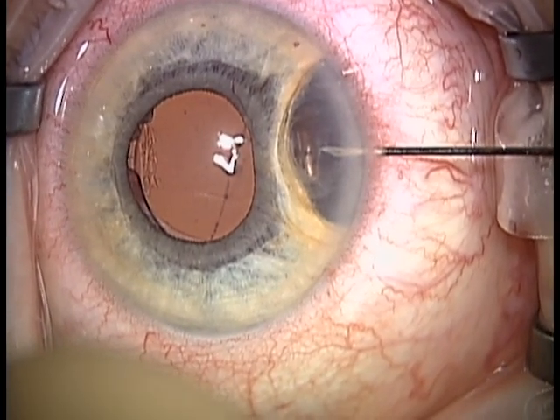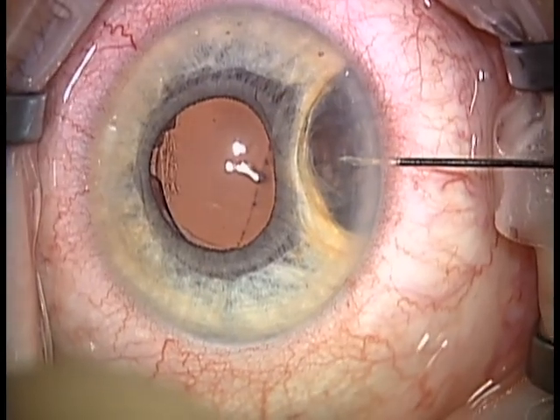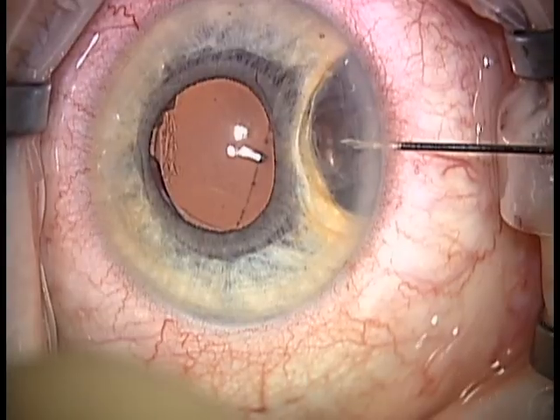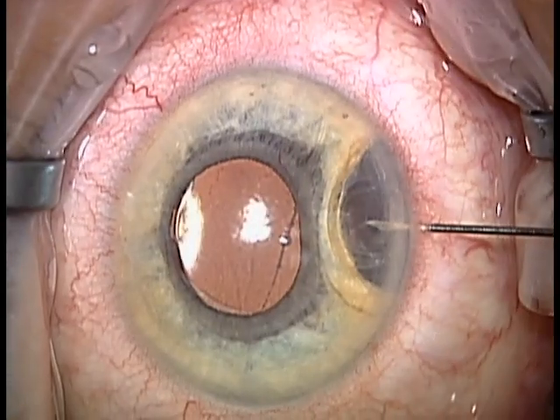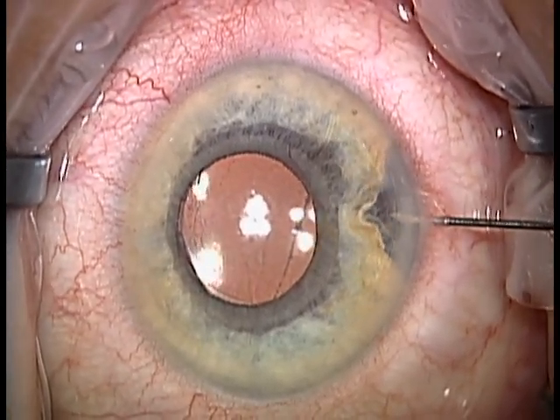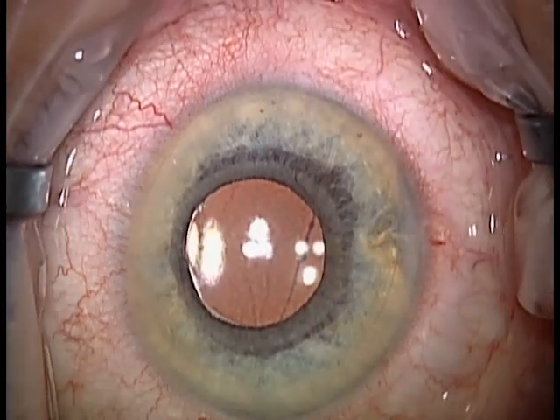Utilizing the aspiration syringe, that ethanol fill is withdrawn and the cyst refilled. I generally do about 3 exchanges of ethanol to make sure that I've killed all the epithelial cells before finally withdrawing the needle and collapsing the cyst for the final time. Following this, the I/A is then used to remove the residual viscoelastic.